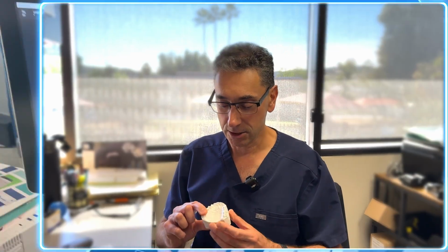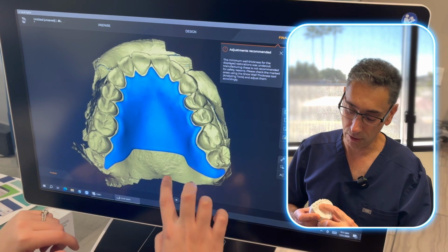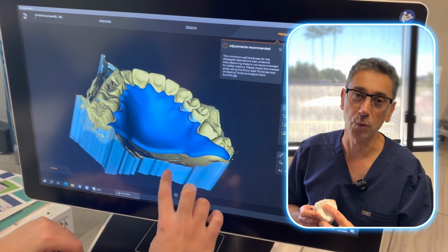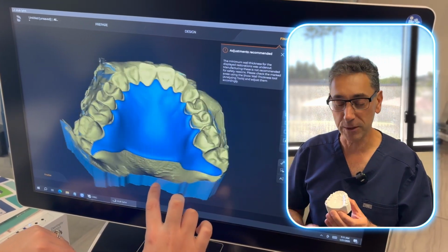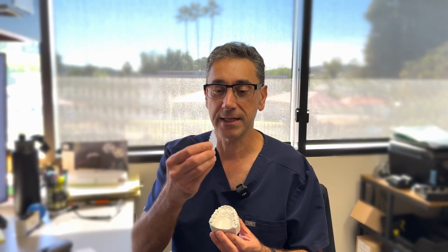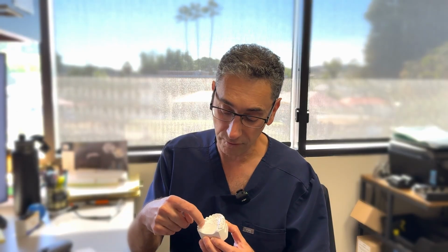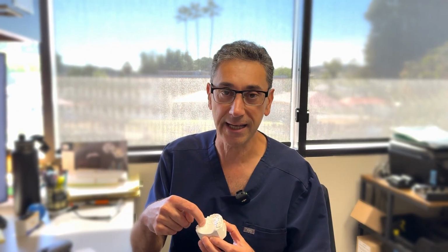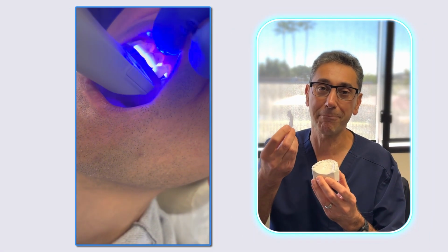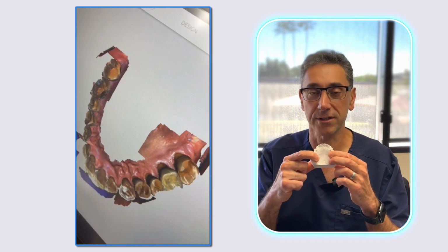And the way I explain it to the patient is, we always have this model. So the palatal area is this, and we're going to borrow the tissue from the roof of the mouth, from the palate. Before we do that, we're going to scan the palate with an intraoral scanner, and then we're going to use our printer to print one of those. This is called a palatal stent. So when we remove the tissue from the roof of the mouth from here and suture that area, we're going to deliver the patient the palatal stent, which goes up here and covers that donor site.